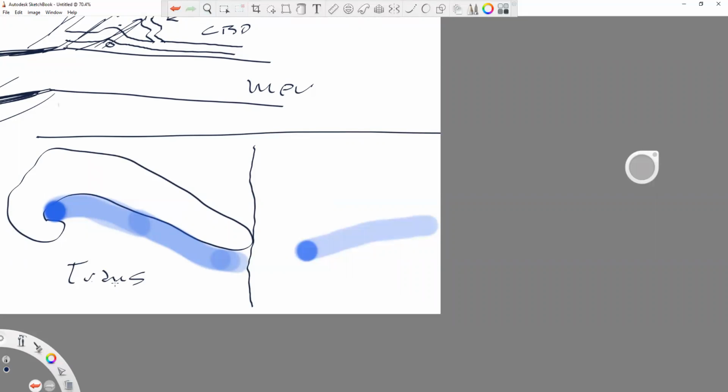This is transverse on the human body, not on the back. And this is a sagittal view. In this case, this was the splenic vein. This is the superior mesenteric vein. But this blue dot is the same point on both of these images, all right? I probably could have drawn this better, but this is it. And then I'm going to go get ready for work.